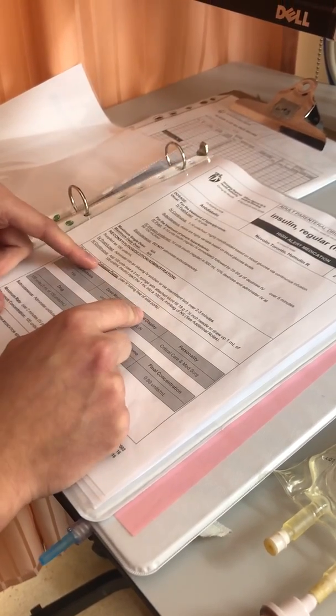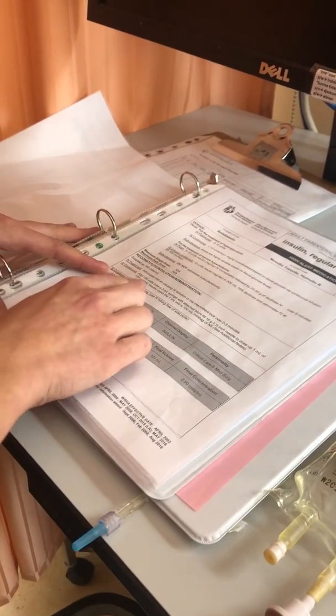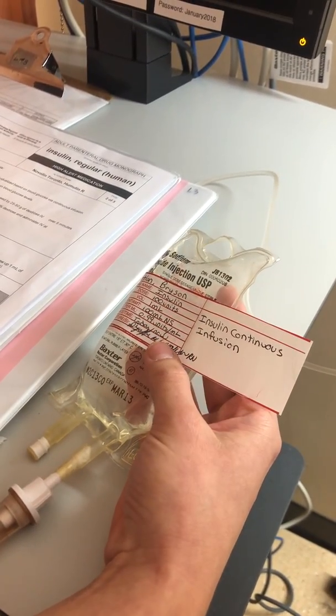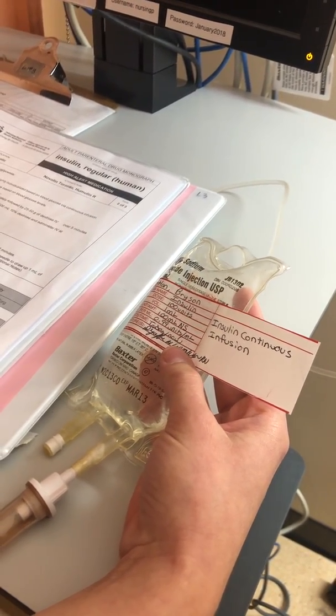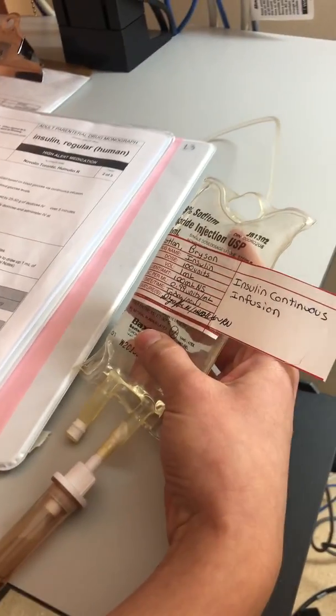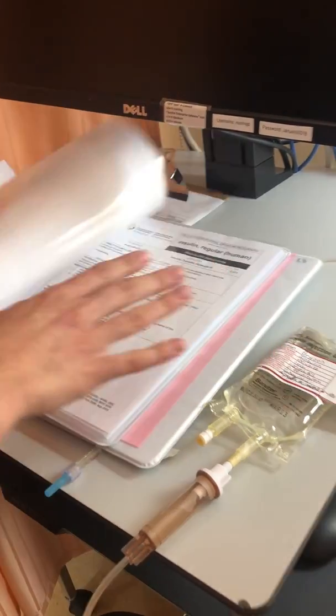So here we are going to use the Colleague Guardian pump, and we are going to do 100 units for the dose. Volume is 1 mL, and 100 mL normal saline mini bag for a final volume of 101 mLs and a final concentration of 0.99 units per mL. So this completes my first check here with the monograph.